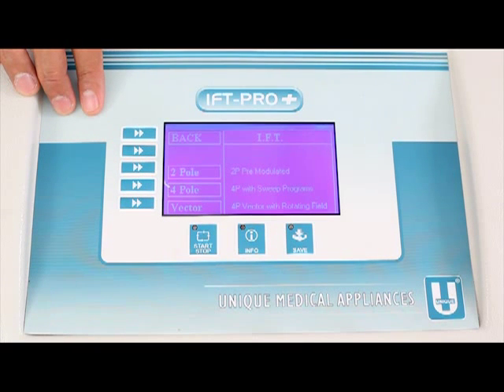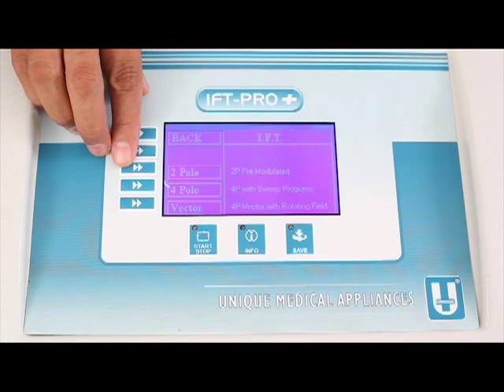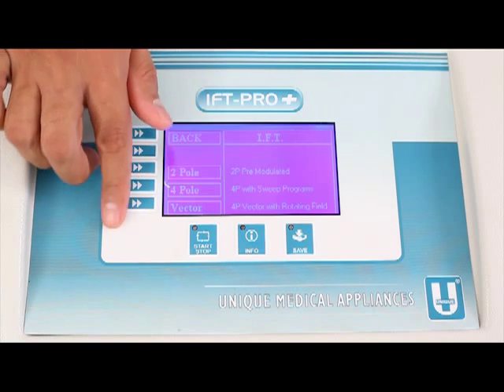Pressing F1 enters the IFT submenu, which announces: F1 Back, F3 Two Pole, F4 Four Pole, F5 Four Pole Vector. It gives us three different IFT options from F3 to F5: two pole, four pole, and four pole vector. Supposing you want to select four pole, press F4.